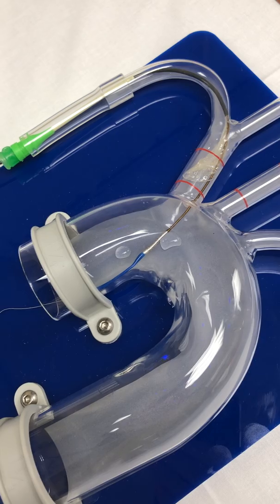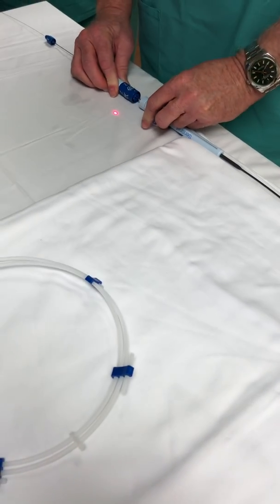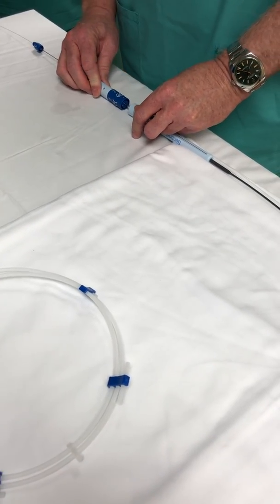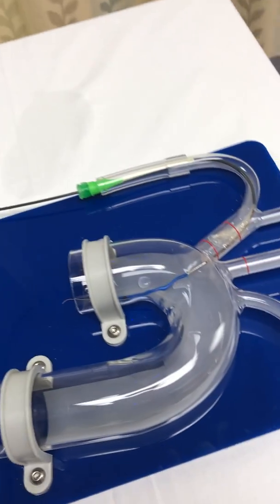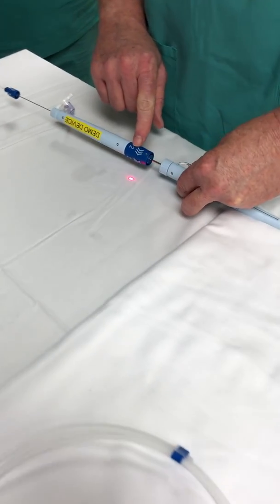Once we've deployed number one, we want to secure that front handle. Now we're going to pull the back handle about an inch apart — about an inch — to bring it a little higher in the aorta. Now we're going to start using number two, which is our articulating sheath, to curve the catheter to point up into the left common carotid.